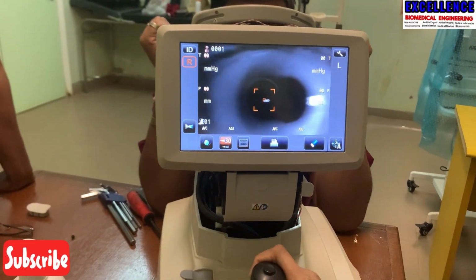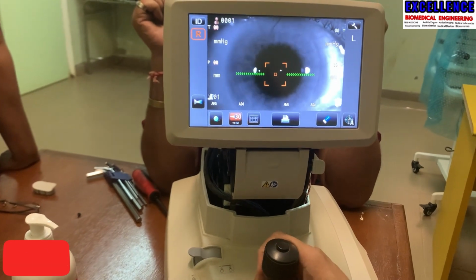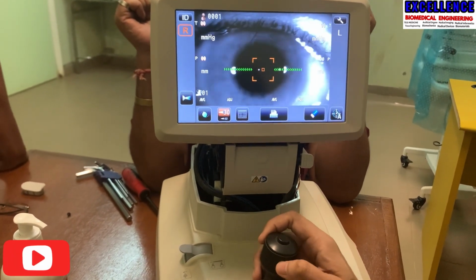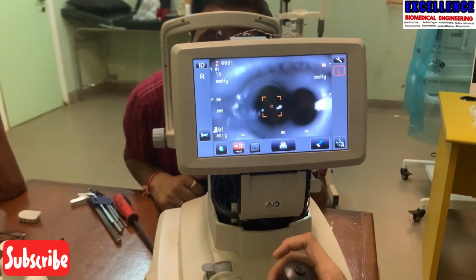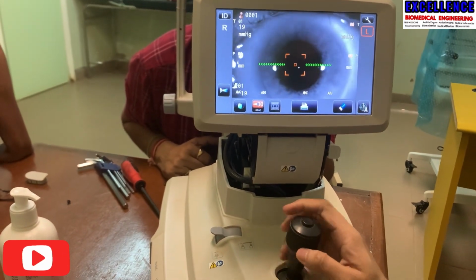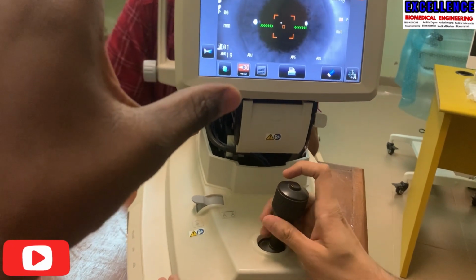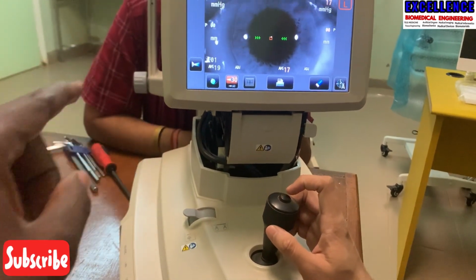See, normally it is not coming. See, he has to press. Oh, yeah. What if we change that one? Maybe error in the thing. Press. You have to target that pink light. Now, go again. Focus. Oh, see, I'm telling you. Focus it.